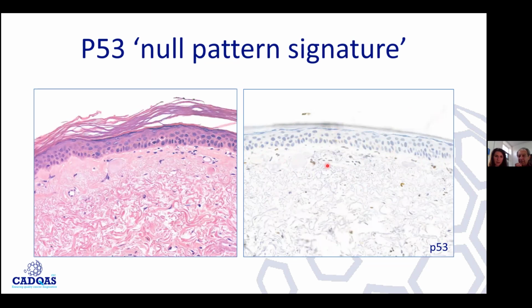So I think this is an important pattern, and this is the reason why for a long time this gene was thought to be an oncogene rather than a tumor suppressor gene, because on many occasions, rather than accumulation, you had loss. So the signals were confusing. And if the assay was not strong enough, even the wild type would have been negative.